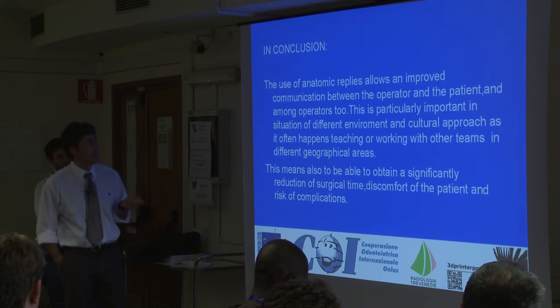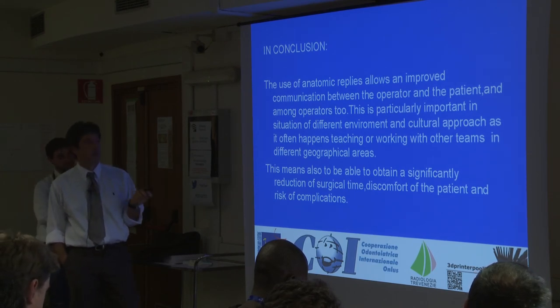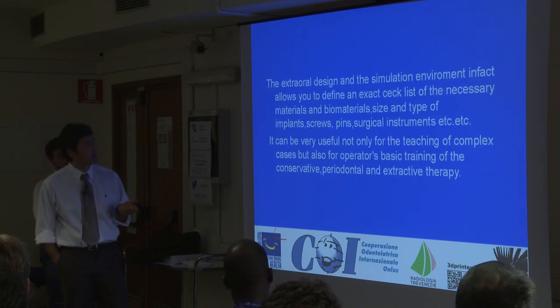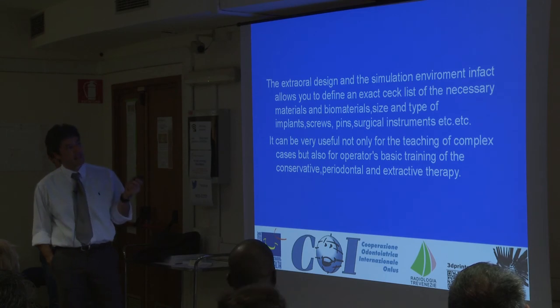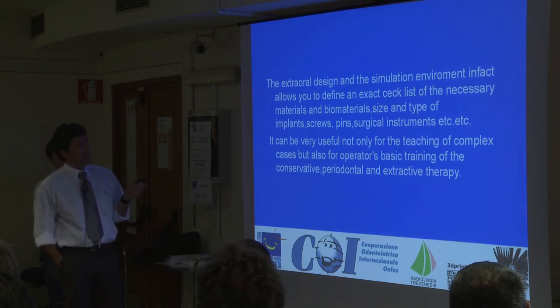This is particularly important in situations of different environment and cultural approach, as often happens when teaching or working with other teams in different geographical areas. This also means being able to obtain a significant reduction of surgical time, discomfort for the patient, and risk of complication. The extraoral design and the simulation environment, in fact, allow us to define an exact checklist of the necessary materials and biomaterials: membranes, implants, screws, pins, surgical instruments, etc.